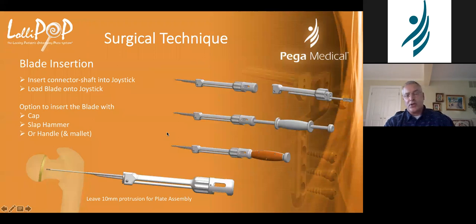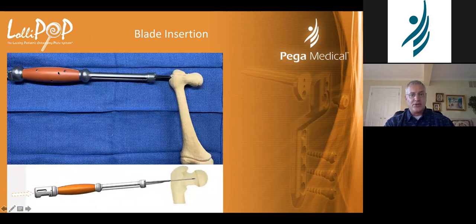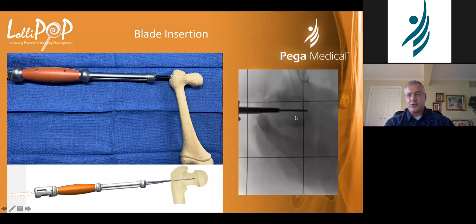So you then put your device together. You have your chisel blade length. That then connects to the connector shaft, which then connects onto a slap hammer, or you can put it onto a handle. You put it over your guide wire, and then you mallet, either with a normal mallet or the slap hammer, and push it into place. So this is another image from the operative guide, connecting all of these little components together. And you then have your blade chisel on your driver, and you're driving it into position. And this is the intraoperative fluoroscopy view, driving it home.